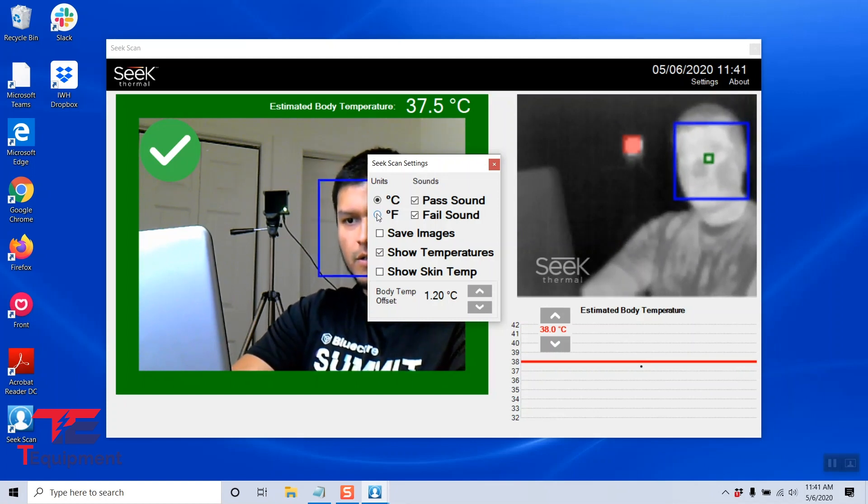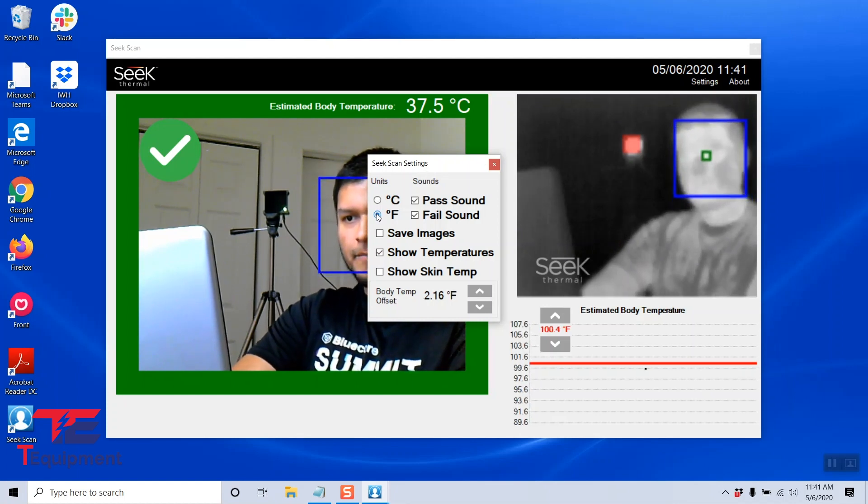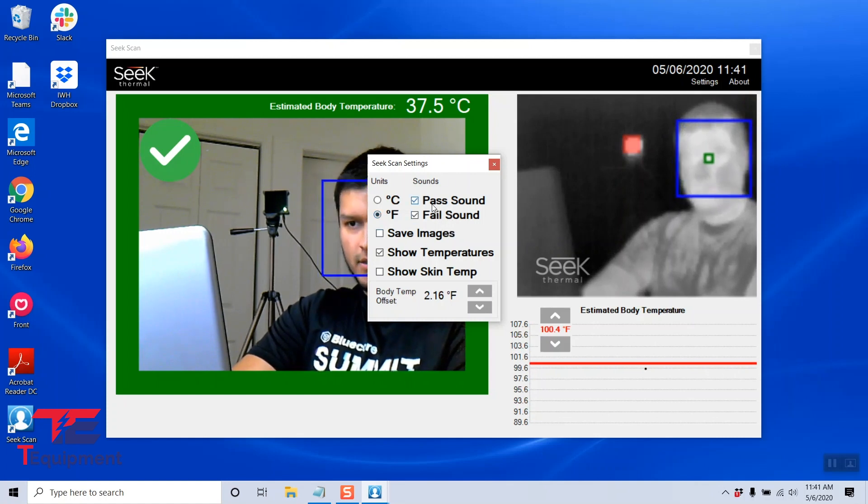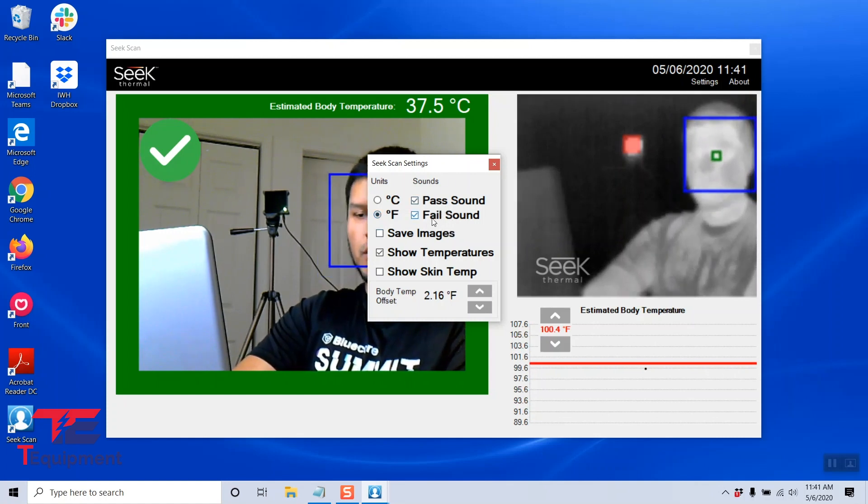I'm going to go ahead and change it to Fahrenheit. I'm also going to keep sounds as is. I do want a sound when it passes and also when it fails.